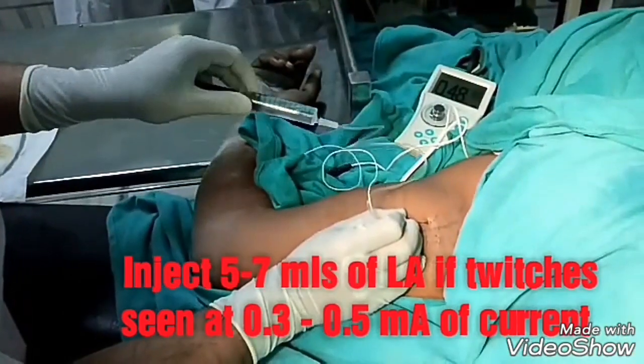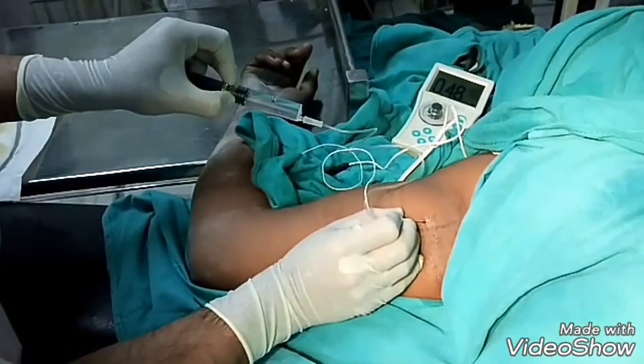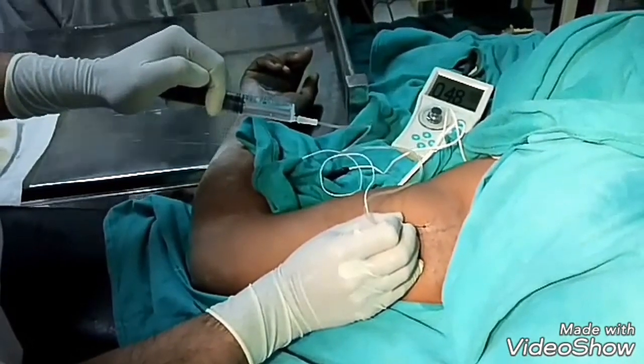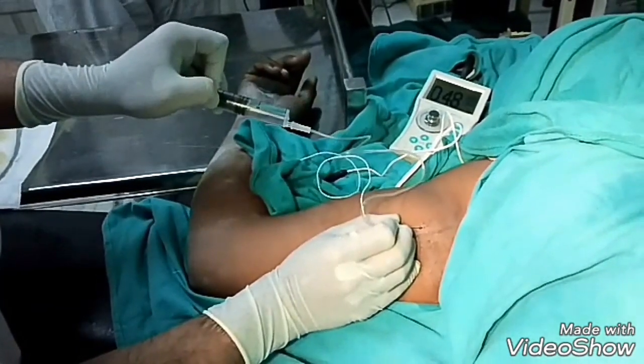So 5 ml to 7 ml I will inject. Just 1 ml — it should disappear, and it has disappeared. So this is the median nerve. Just 1 ml. Aspirate. And it is 5 to 7 ml — so this is the median nerve.